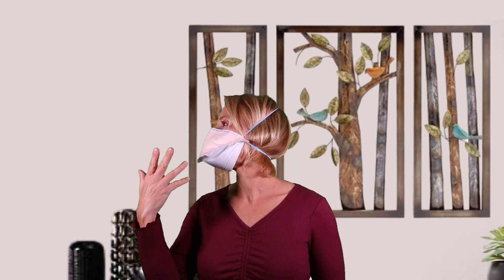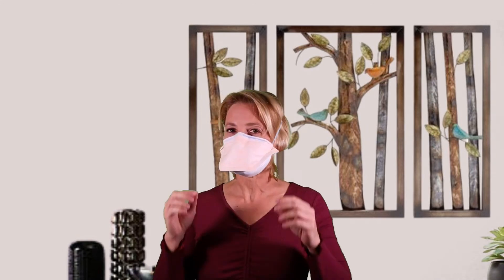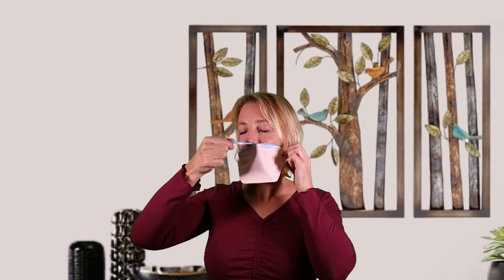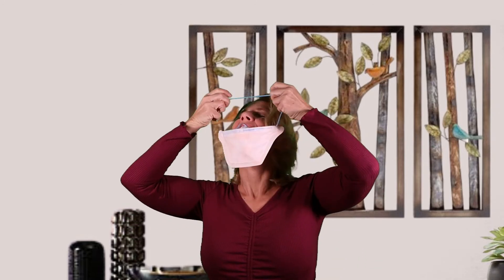You can see why it's called the duckbill. When taking it off, take the strings off first. If you've been wearing this for a long time in an isolation room, you really don't want to grab the outside of the mask. Take it off by the strings and then throw it away — these are meant to be single use.